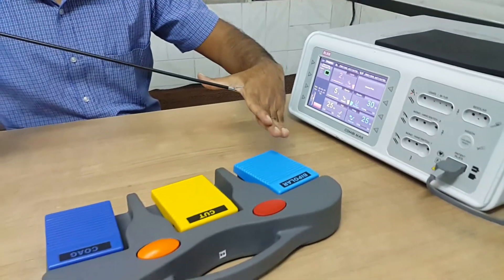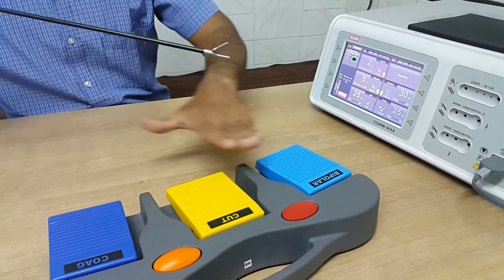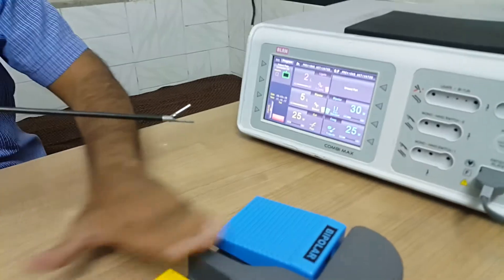So the workflow will be: ligate, cut, ligate, cut — repeating the sequence. This means simultaneously you can use all three modes as per your convenience.